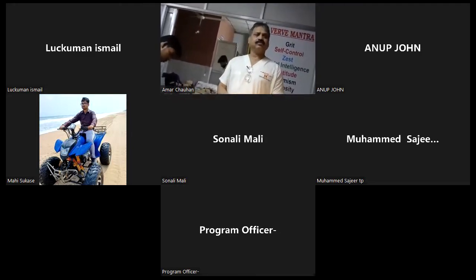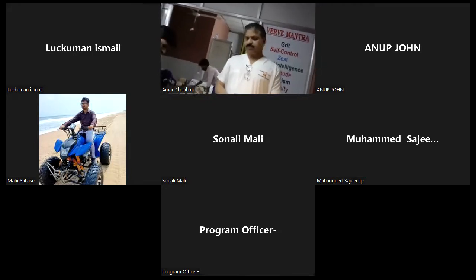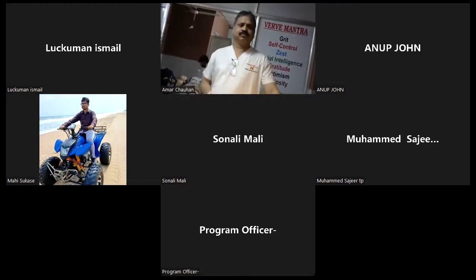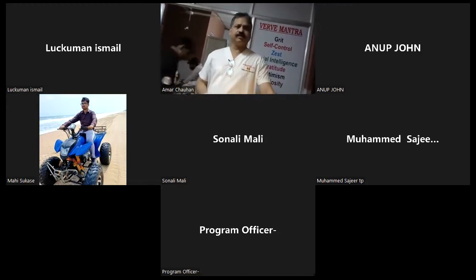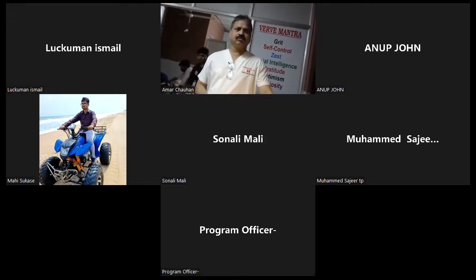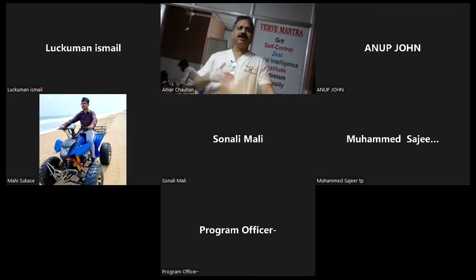Any doubt on this? Any clarification you require, sir? Initially the IO, how does the ventilator simulation work on that? On which mannequin? Which one? The needle ICD trainer. ICD, it will inflate and deflate the lungs.